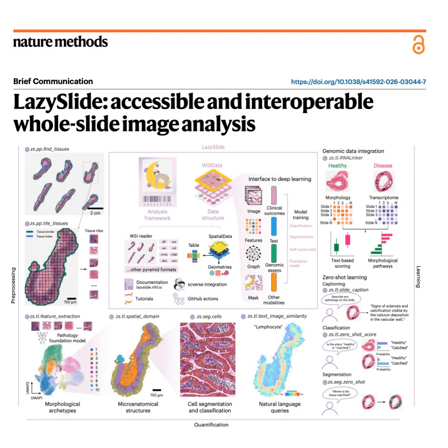To really understand why LazySlide is such a necessary breakthrough, we kind of have to start with the sheer physics of a whole slide image. Yeah, let's unpack this, because a WSI is not like a standard JPEG you have on your phone. Not at all. We're talking about gigapixel scale. A single slide of a tumor biopsy, when it's scanned at high magnification, contains billions of pixels. Billions, just in one slide. Exactly. And they're stored in these highly proprietary vendor-specific formats like .svs or .ndpi. They operate almost like a pyramid of images layered on top of each other at different resolutions. And if you try to load even a few of those into standard RAM, what happens? Oh, your standard computing environment will instantly crash, just completely lock up.